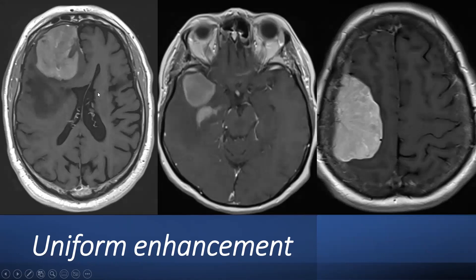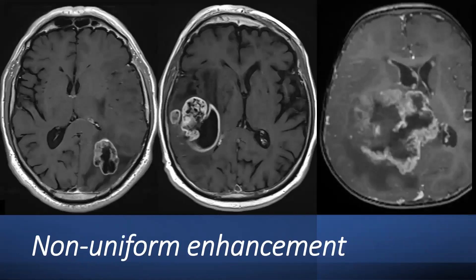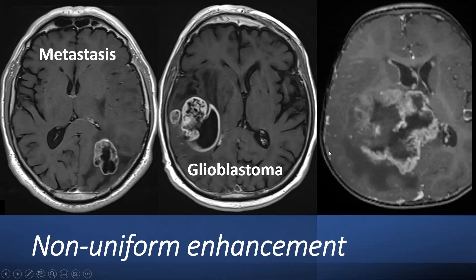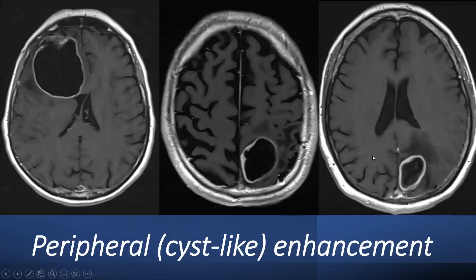Uniform enhancement is typically seen in CNS lymphoma and also in meningioma. Heterogeneous, non-uniform enhancement is more typically seen in very aggressive tumours that grow so fast the centre becomes necrotic — examples include metastasis and glioblastoma. In children, a central necrotic tumour should also make you think of atypical teratoid rhabdoid tumours, other embryonal tumours, or anaplastic ependymomas — aggressive high-grade tumours should always be in the differential.